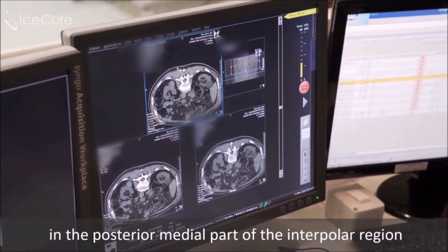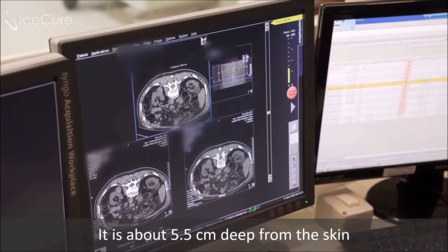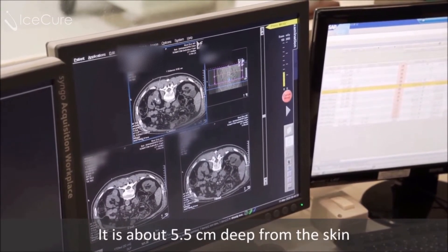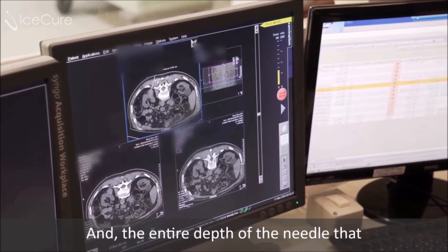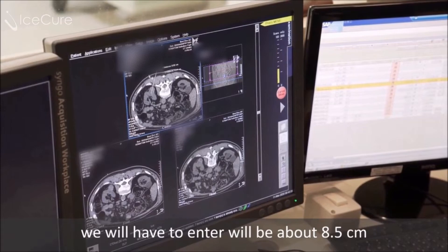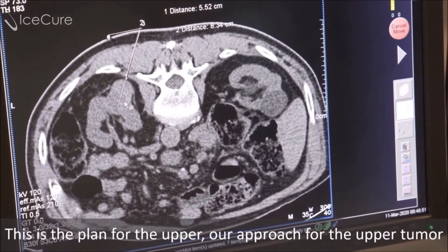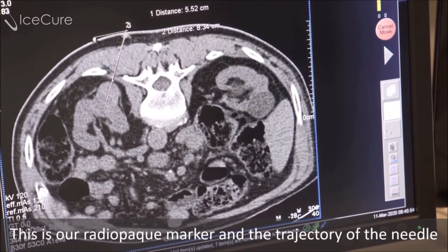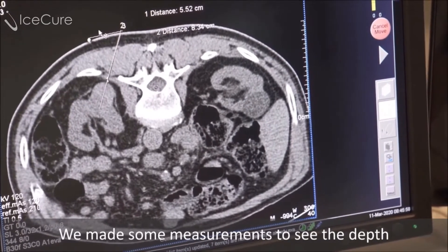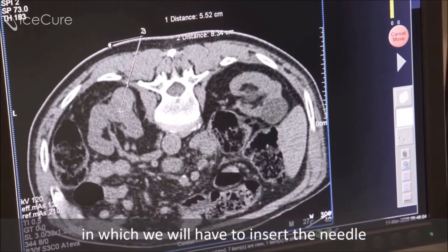We can see that the upper tumor is located here, in the posterior medial part of the interpolar region of the left kidney. It is about five and a half centimeters deep from the skin, and the entire depth of the needle we will have to insert will be about eight and a half centimeters. This is the plan for our approach to the upper tumor — this is our radiopaque marker and this is the trajectory of the needle, with measurements for the required insertion depth.